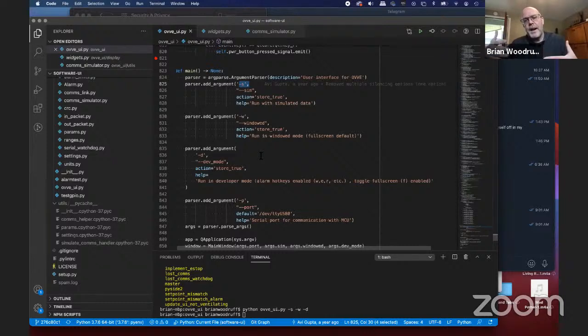There's a Raspberry Pi that's running the UI, and then there's an Arduino that is running the controller. And these two things communicate. The UI is basically just listening for messages from the controller and responding to those and displaying the current state of the system. And there's some handshaking that goes on at init time.